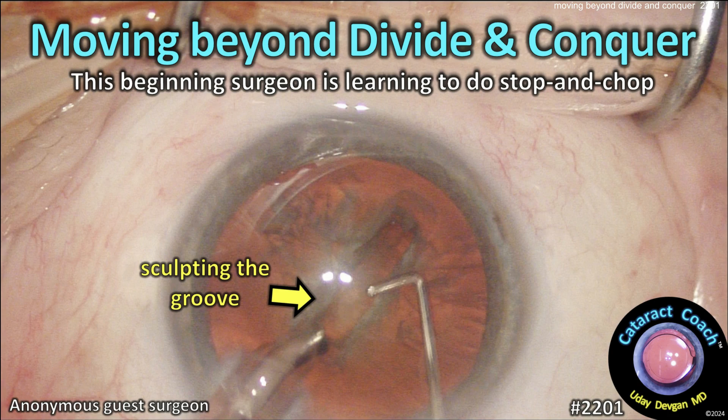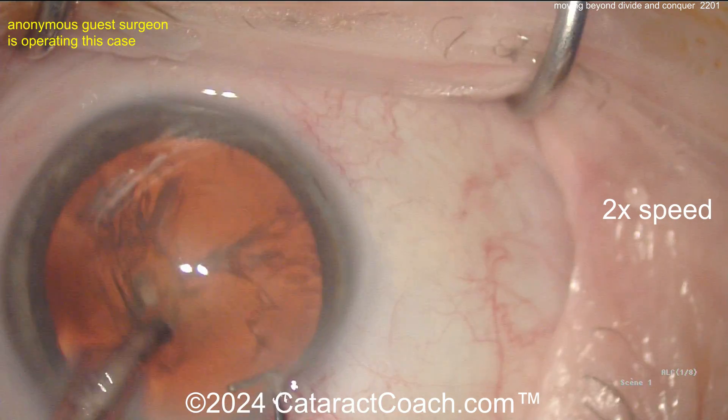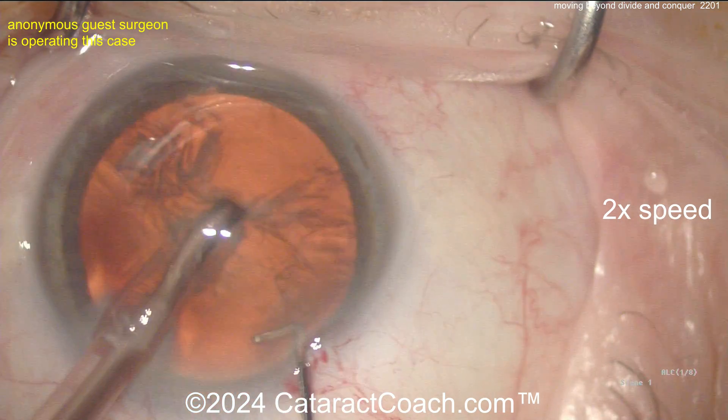cataractcoach.com — moving beyond divide and conquer. This beginning surgeon is learning to do stop and chop — bravo! I like divide and conquer on rare occasions, I still do it, but I think you need to learn all the techniques.